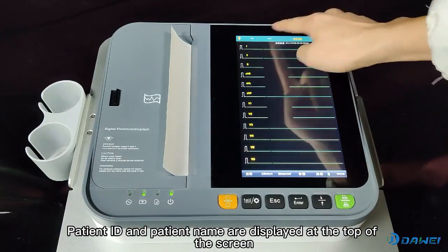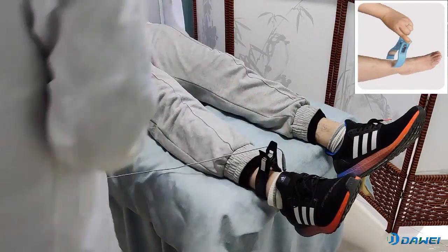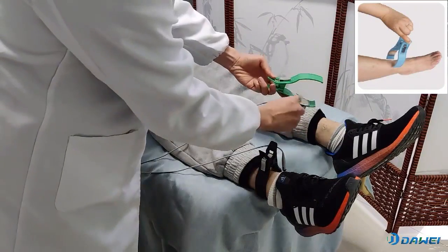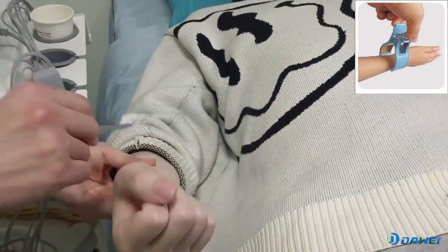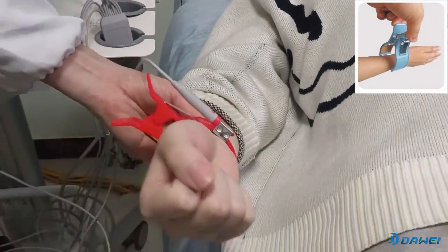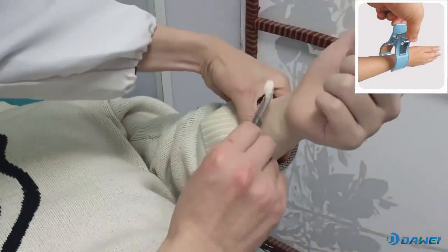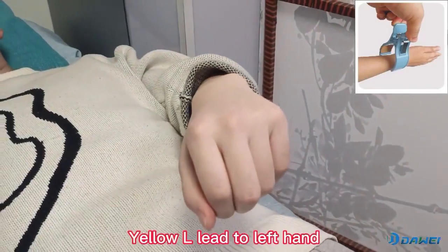Patient ID and patient name are displayed at the top of the screen. Wash the skin surface where the electrodes are to be placed. Place the electrodes on the skin surface. Green lead connects to the left foot. Red lead connects to the right hand.